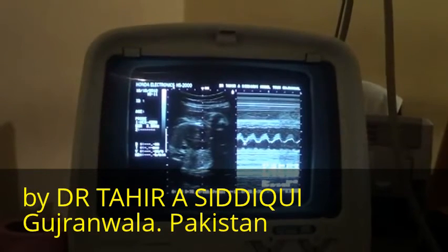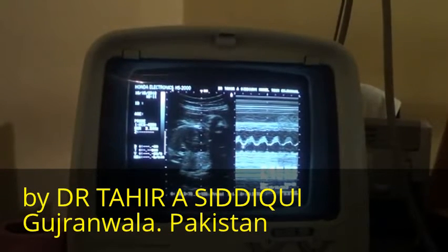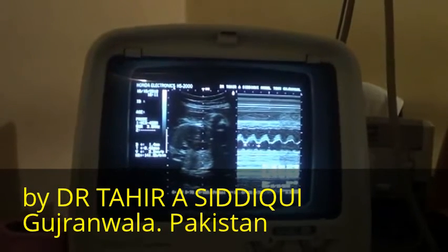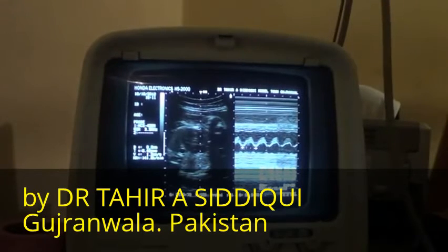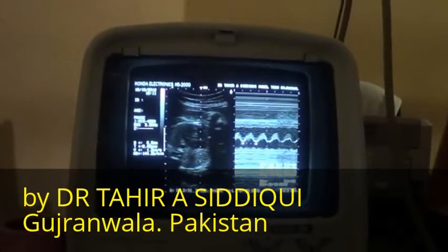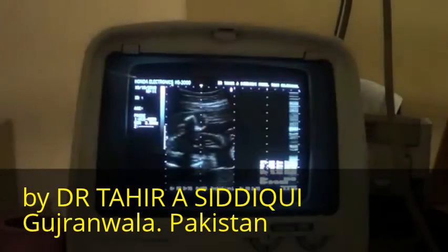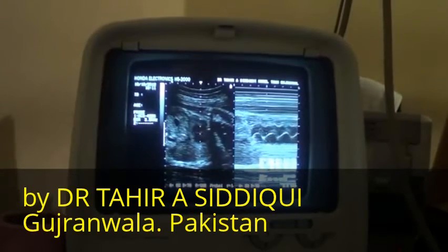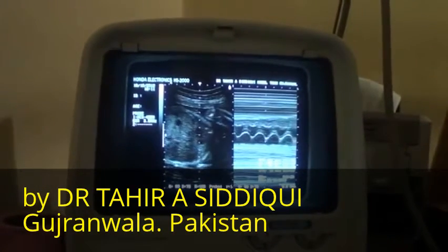So the fetal cardiac activity is 141 beats per minute with regular waveform. See that the waveform is regular.